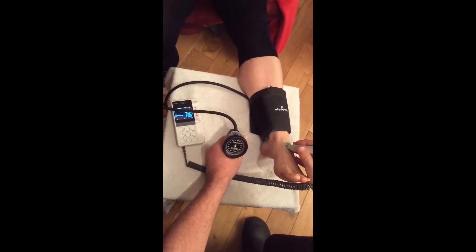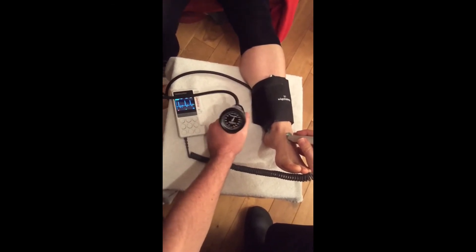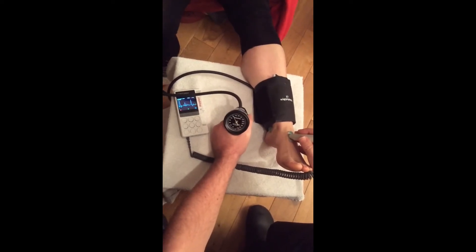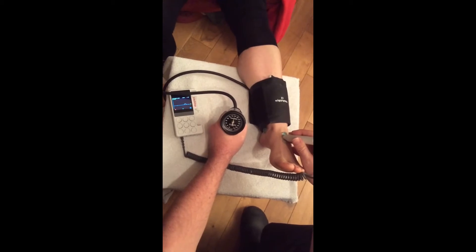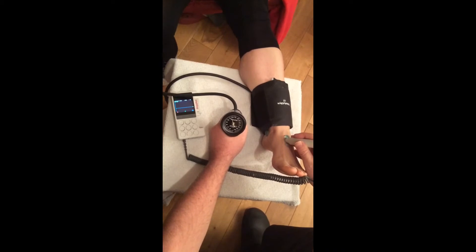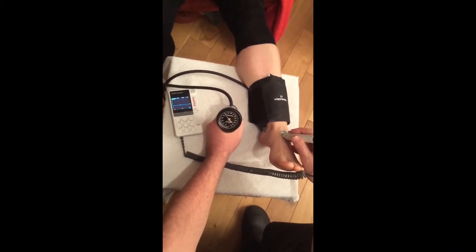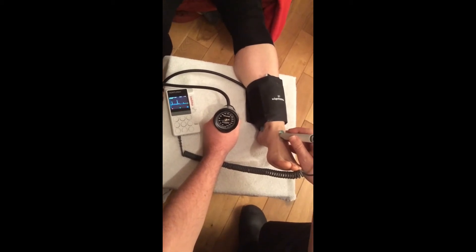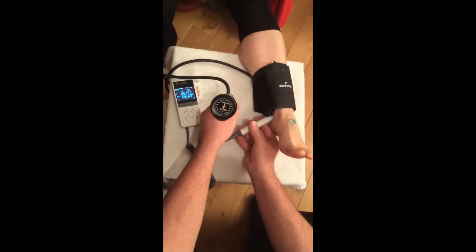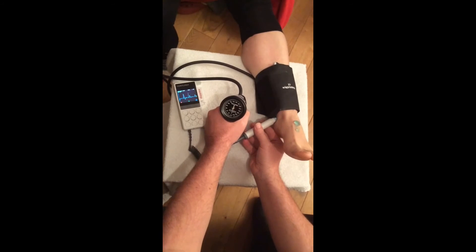Inflate the sphygmomanometer cuff until the audio disappears. Reduce the pressure slowly using the trigger. Record the pressure of the first audible return, then deflate the cuff and repeat on the other artery.